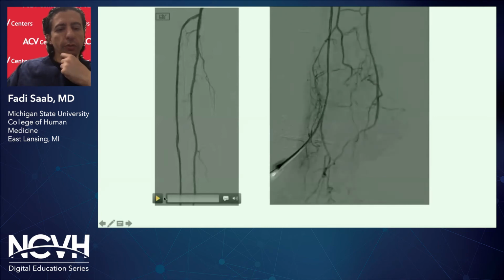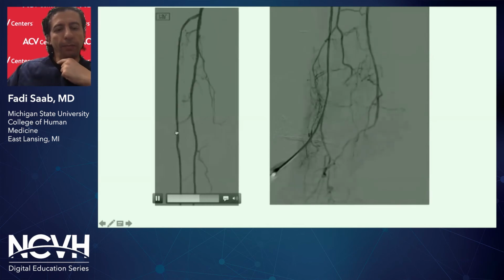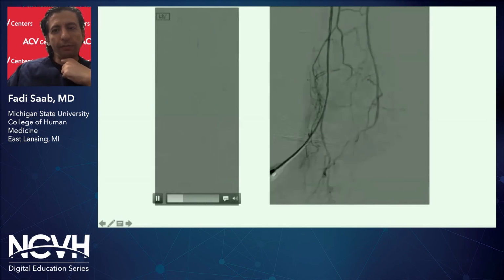So I want to show you the final result. We treated the SFA and the popliteal. It was non-occlusive.